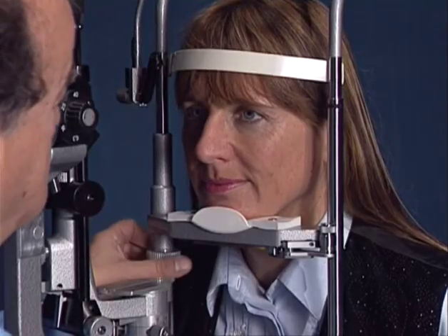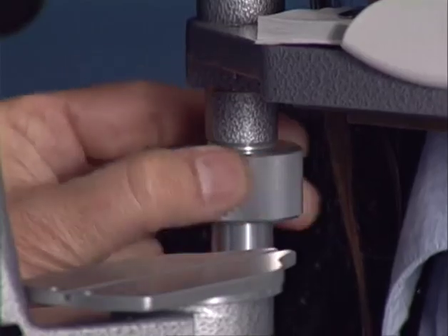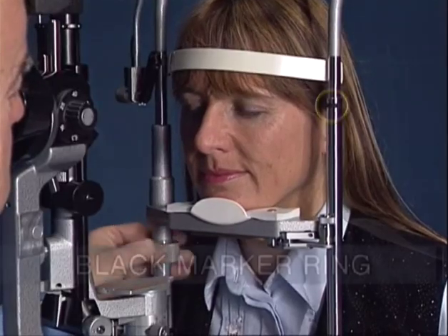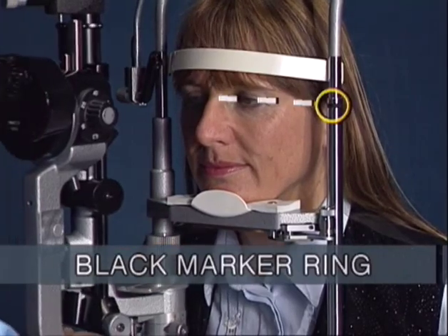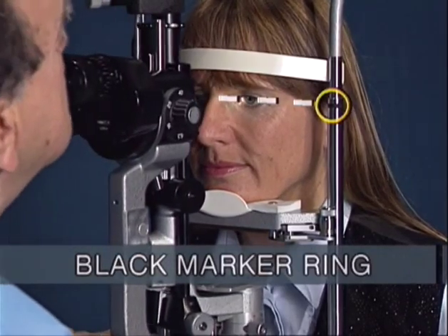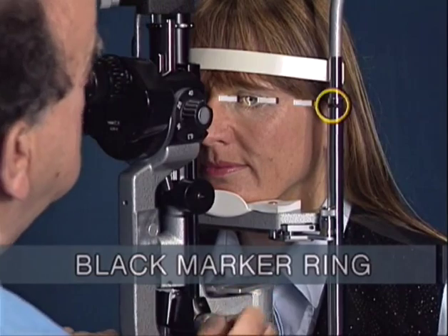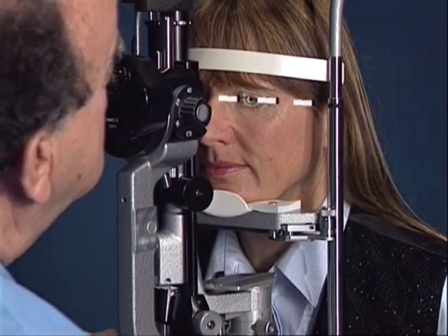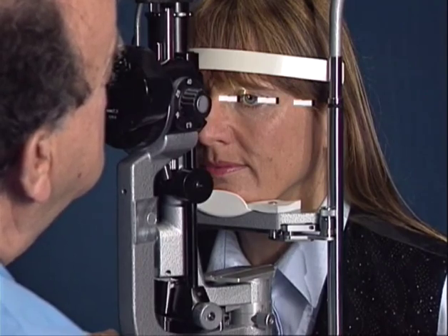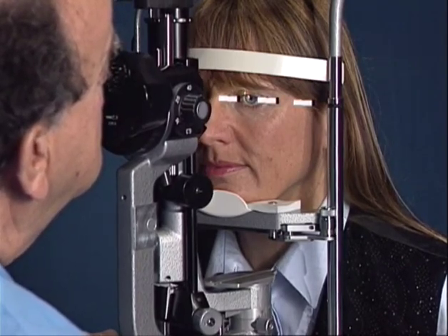For maximum ease of examination, the chin rest is lifted until the center of the patient's cornea is level with the black marker ring. The black marker ring indicates the mid-position of the up and down movements of the slit lamp. Therefore, if the patient's eye is right at this level, it can be examined entirely by just rotating the joystick without any further adjustments of the patient's head position.